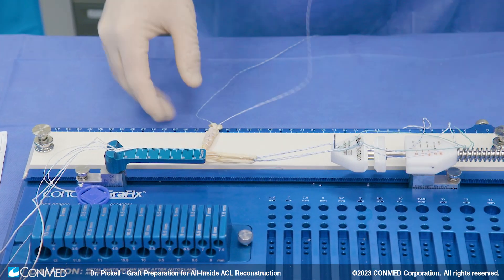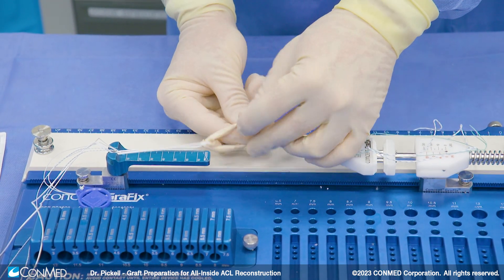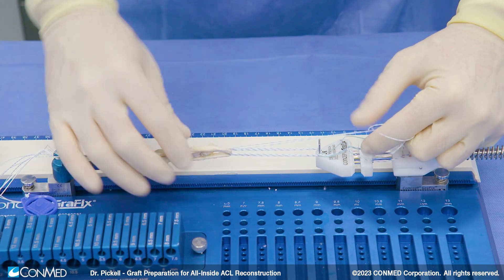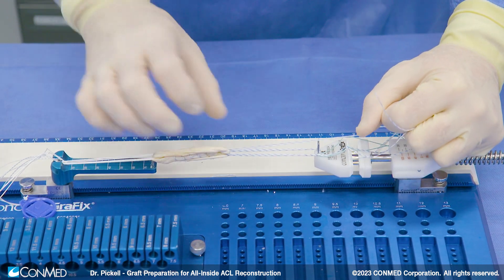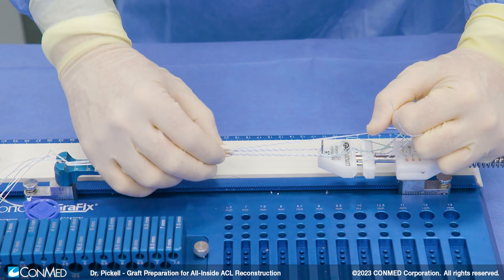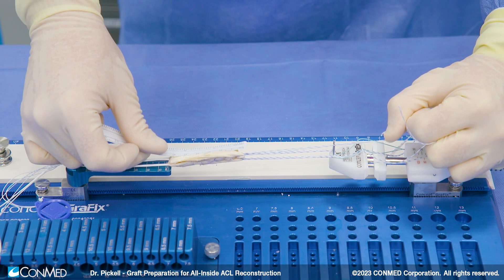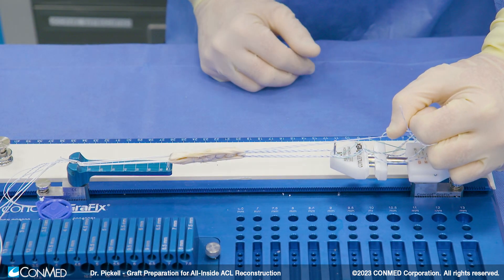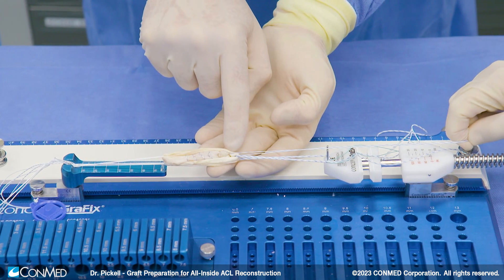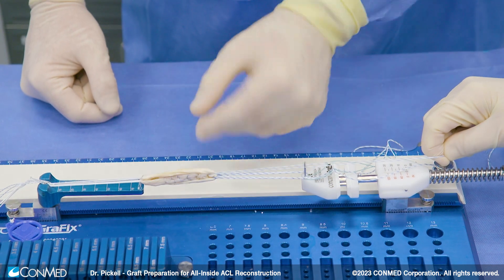The next step is to pass one limb of our two suture ends back through the center of this graft. Now we've got a tail on either side, and we're going to increase our graft length — this is where we want to get it dialed in to about 65 millimeters. By doing this, you can see our graft is getting tucked into the middle. We then bring the two tails right to the tip of the tendon, and if we measure that it should be about 65 millimeters — and we're bang on. So that's what our final construct is going to look like. The key is we want to make sure we keep the end of these tails sitting right against the crux of the rest of the tendon.